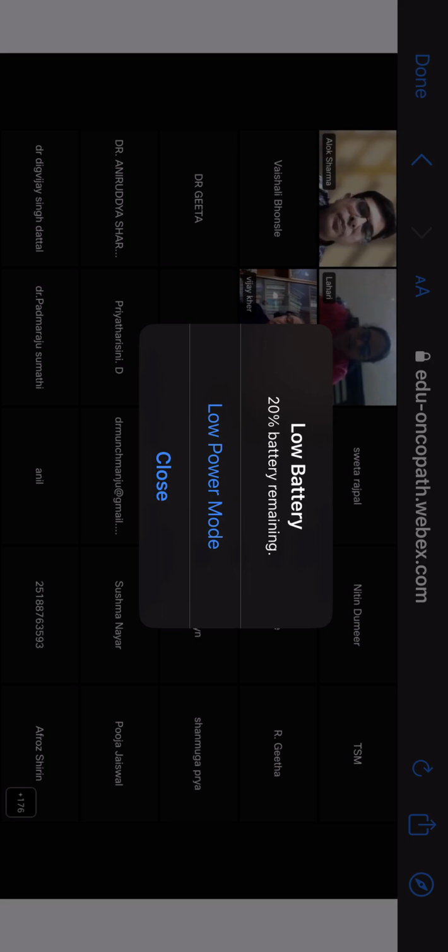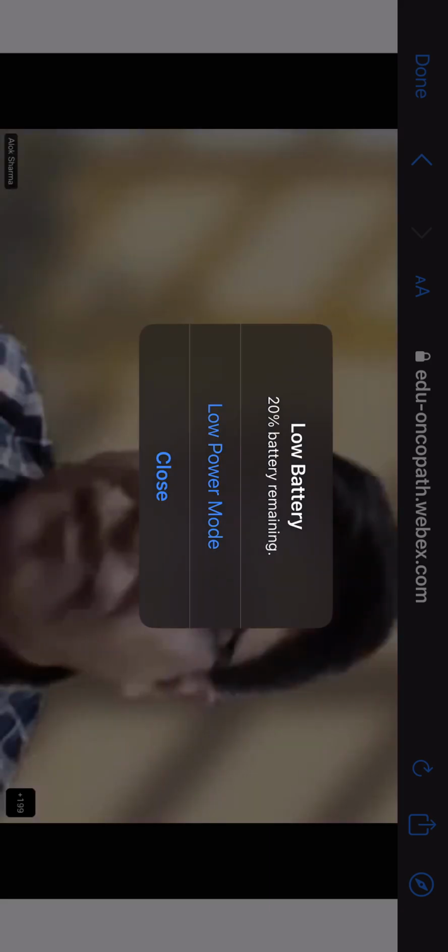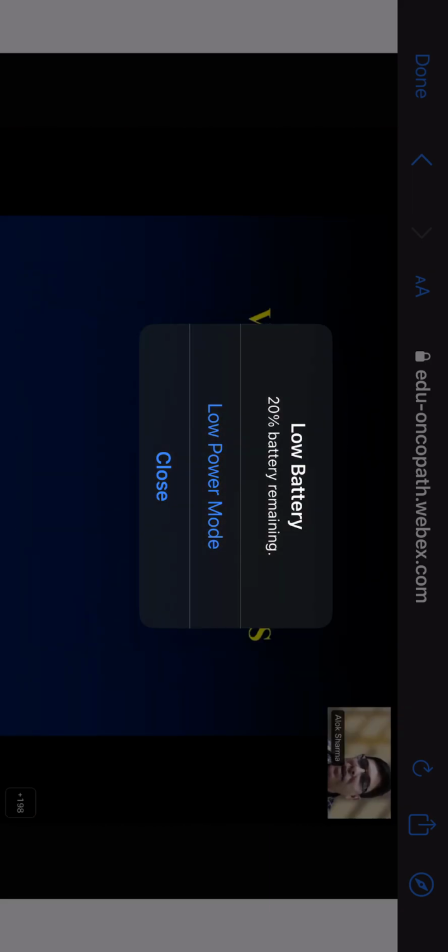Dr. Shivansu requested to show the deposits in membranous pattern, sir. Okay, so you want to go back to the presentation again? Yes, sir. Okay, I'll do that. Is the screen visible? Yes, sir. Okay, so I'll just go back to that particular case.